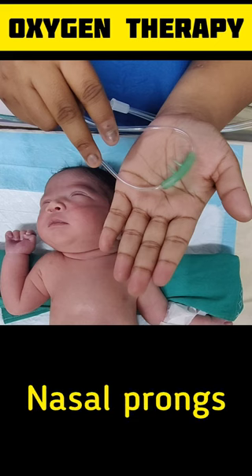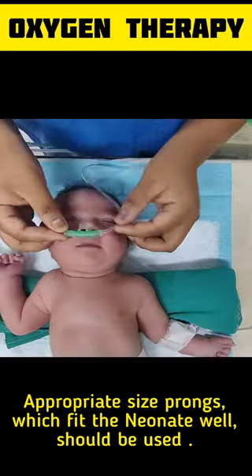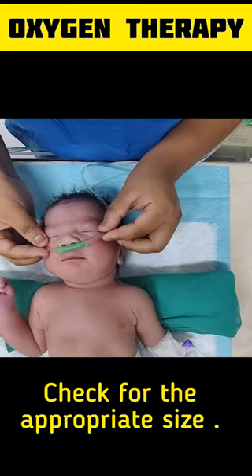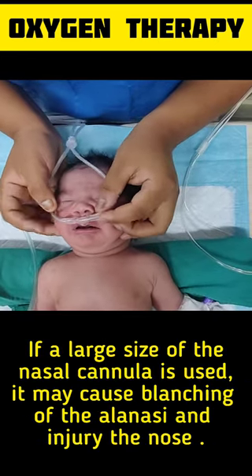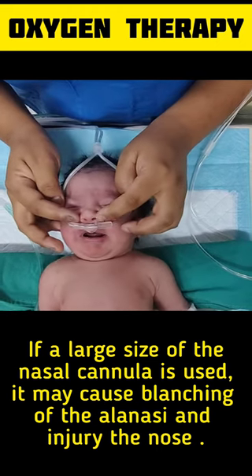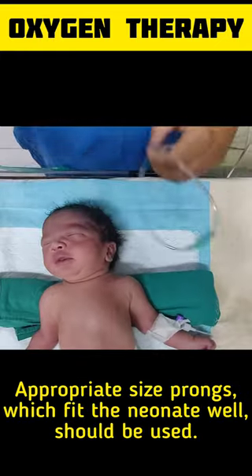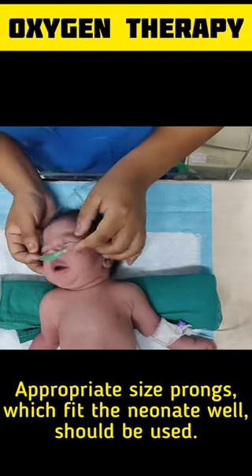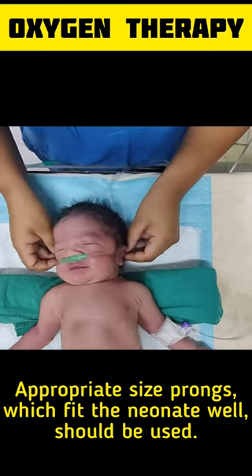For nasal prongs, first we have to choose an appropriate size. If a large size nasal cannula is used, it may cause blanching of the alae nasi and injure the nose. So appropriate size nasal prongs which fit the neonate well should be used.